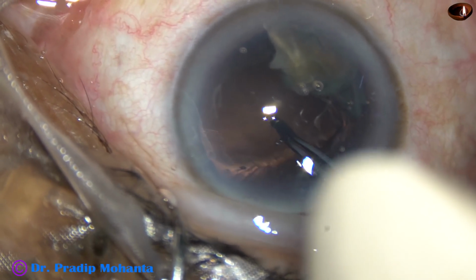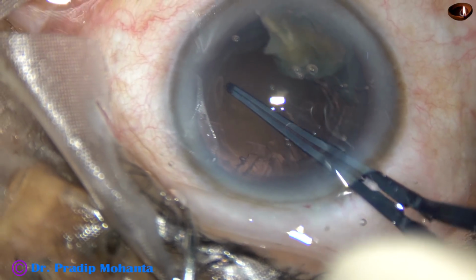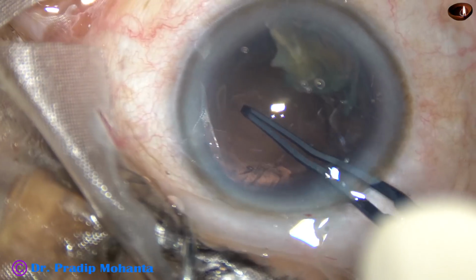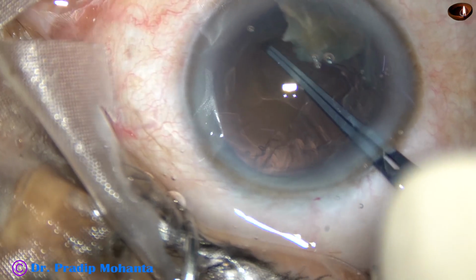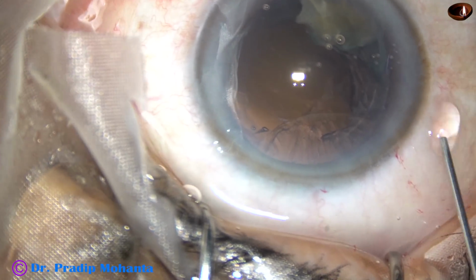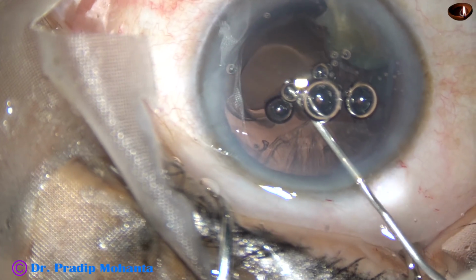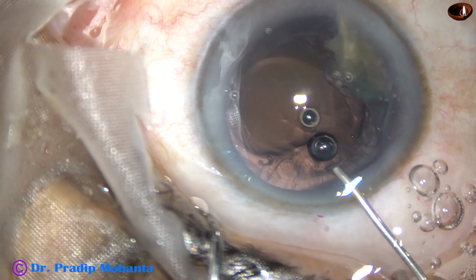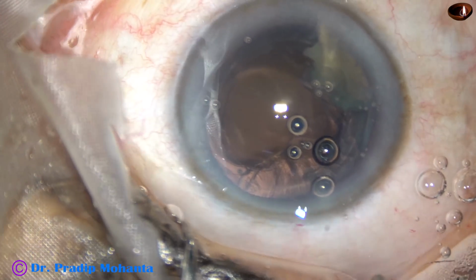So I'm trying to convert this small tear into a posterior CCC, and here it is. I could do it. So there is a small posterior rhexis, and now by this time I have got viscoat from Alcon, and I have applied that to plug the posterior rhexis.